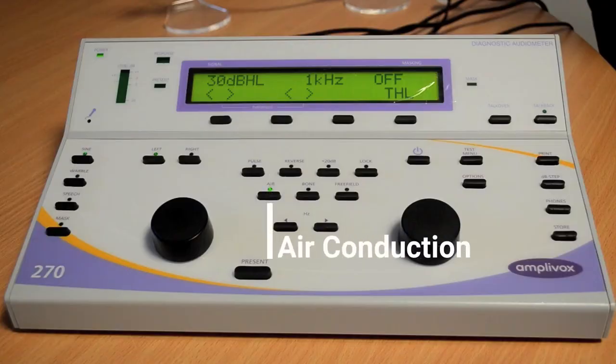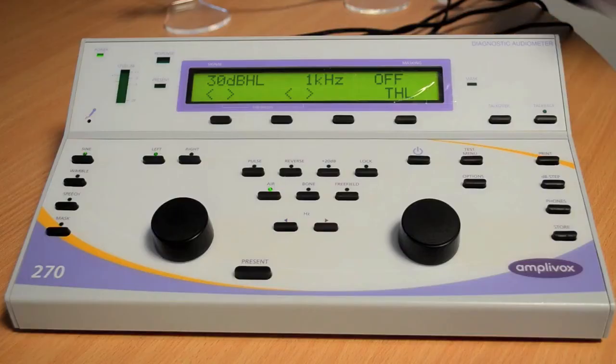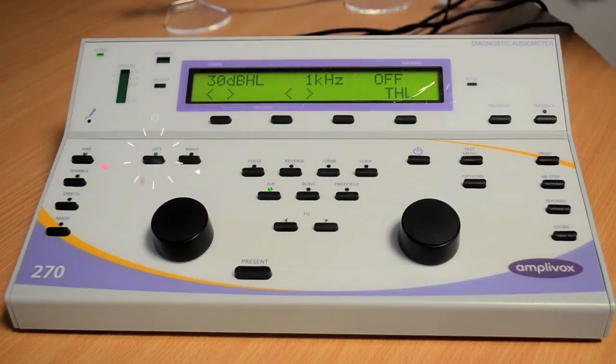When you turn the Amplivox 270 on, it will be in air conduction mode. There are no hidden functions on the 270 — every function has a button. When you select a function on the 270, an LED light will appear, letting you know that that function has been selected.